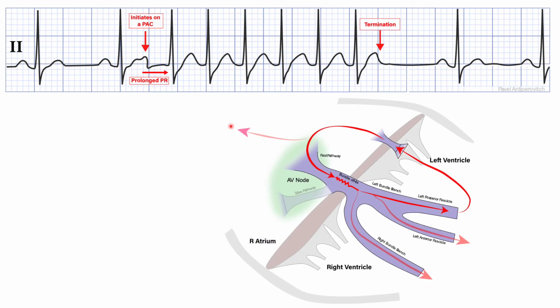Next, let's look at AV-RT. AV-RT very commonly initiates with a PAC, which blocks in the accessory pathway anterogradely, goes down the AV node, where we experience a physiological decrement, as we did with an atrial tachycardia, and then the AV-RT initiates. So yes, this can certainly be explained by AV-RT.